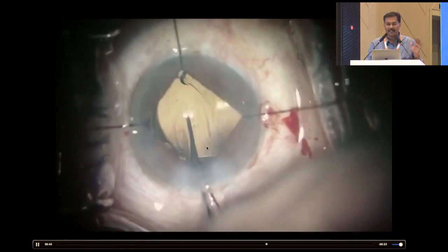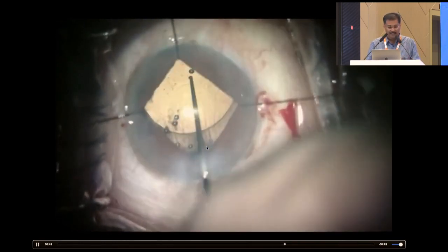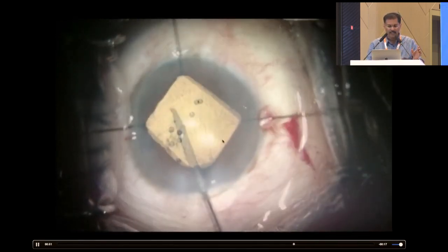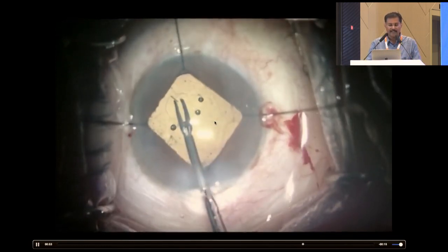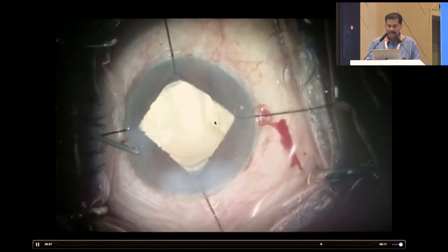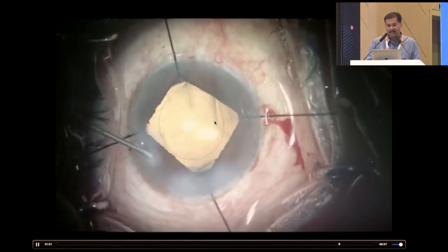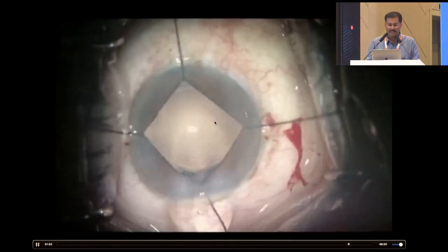It is not as weak as it has been told. It is quite a strong rhexis margin still. Now you can notice that it is very small. So I take the liberty of having the initial rhexis margin as the guide and do as round a possible rhexis with my hands for this patient.